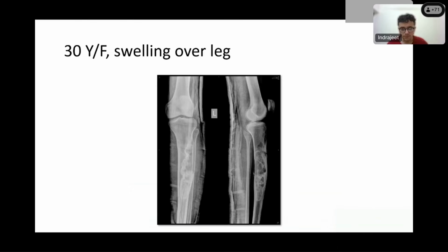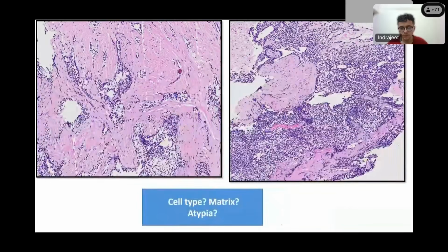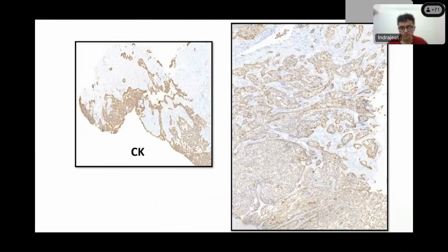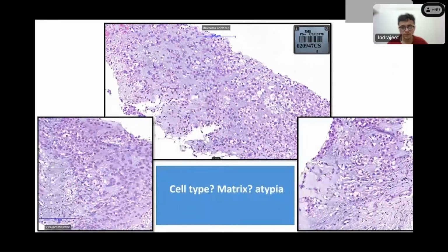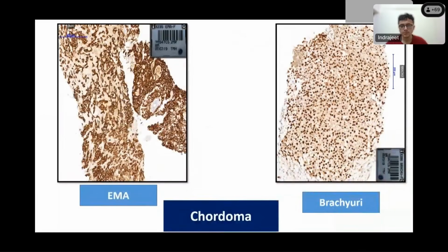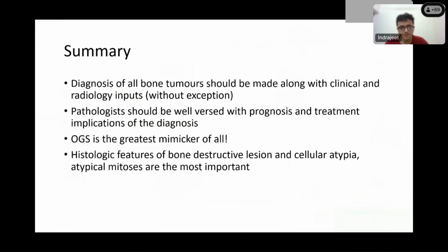I think we should stop here. If there are any questions, we can take them. This was one nice case of adamantinoma that I wanted to show. This was one case of a chordoma that I wanted to show, which shows EMA positivity and brachyury positivity.